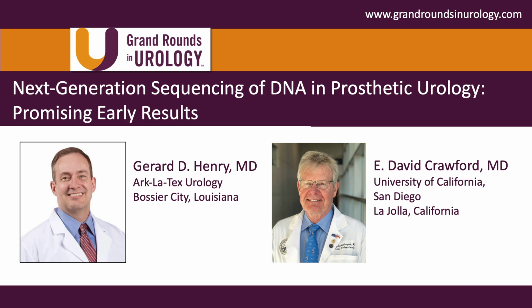I have an Excel data sheet of over 400 patients with bacterial cultures, and I'm finding brand new bacteria, several bacteria. One of the things I love, as I alluded to earlier, is that the abundance tells me exactly which one appears to be actually causing the infection.